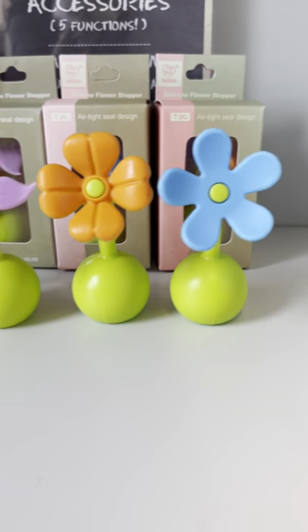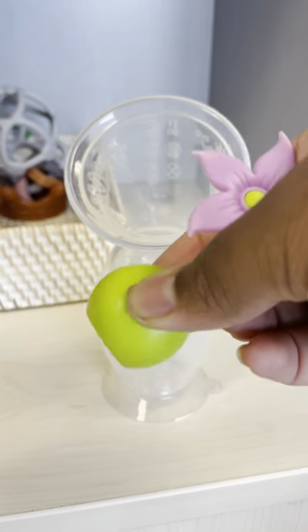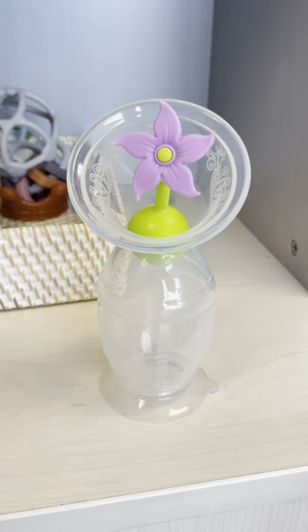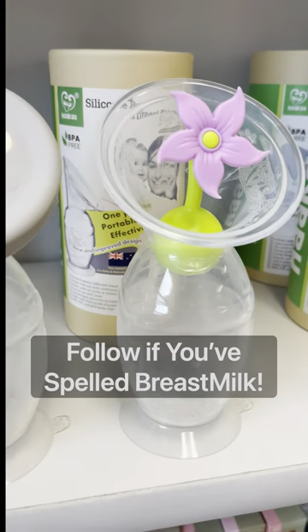The flower stoppers come in four colors, and you insert them in the neck of your Haakaa pump. The great thing about the flower stoppers is you can insert them with one hand. If you don't know which one's for you, you can never go wrong with getting both. No more crying over spilled milk!